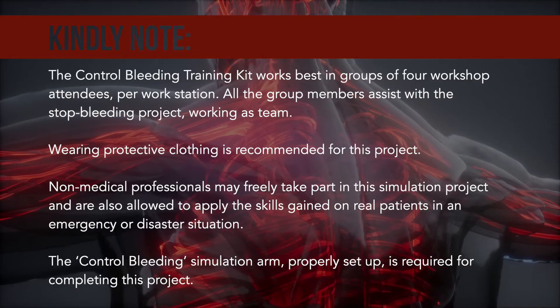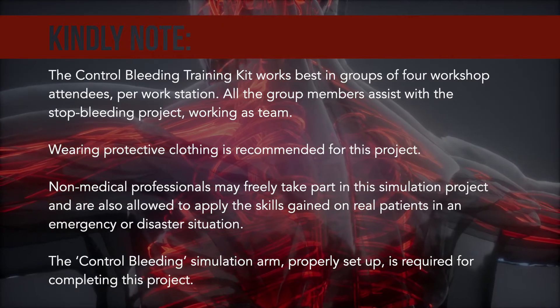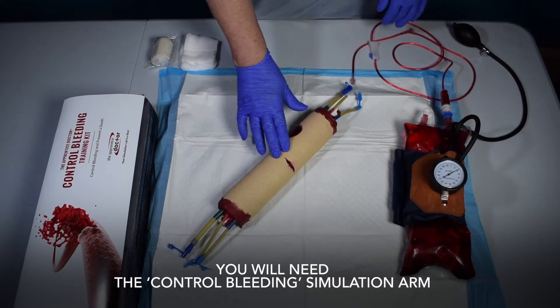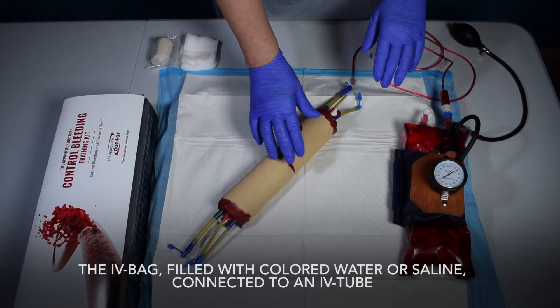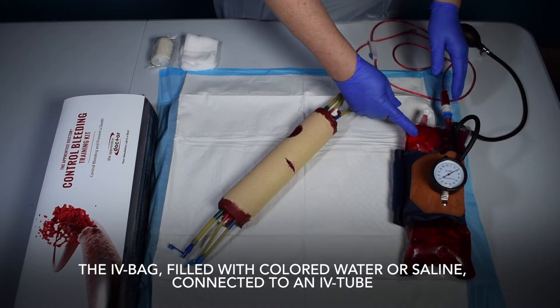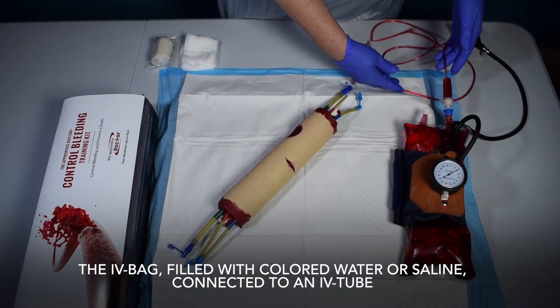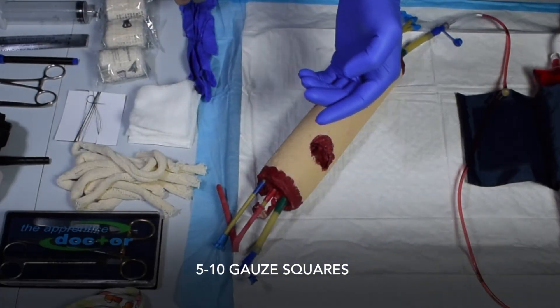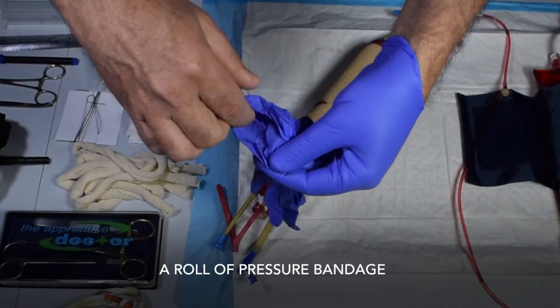The control bleeding simulation arm, properly set up, is required for completing this project. You will need the control bleeding simulation arm, the IV bag filled with colored water or saline connected to an IV tube, the sphygmomanometer, 5 to 10 gauze squares, and a roll of pressure bandage.